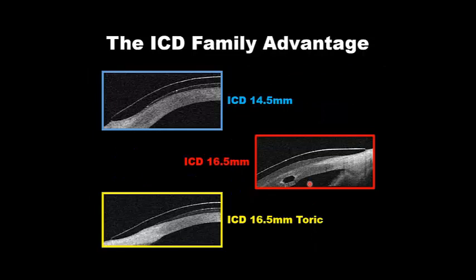So the ICD is unique in that it's built based on a tangent construction, and you can kind of make that out, the straight lines that exist that follow the contour of the peripheral cornea and the limbus, and then you have this unique landing zone that's quite forgiving. And this is one of the advantages of the ICD. This surface that we use for landing allows it to be fit on a wide range of scleral angles. So having blanching problems with the ICD is far reduced than it is with conventional designs.